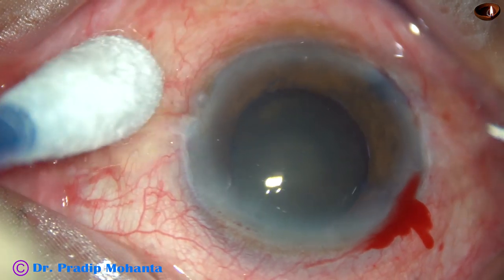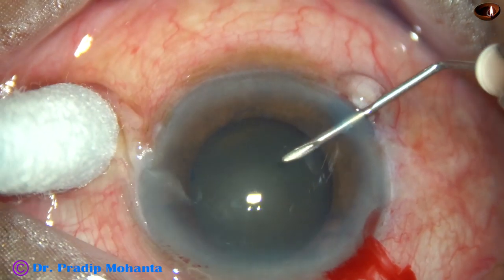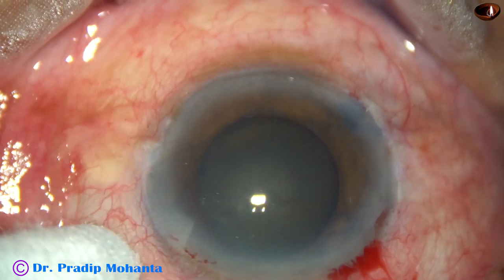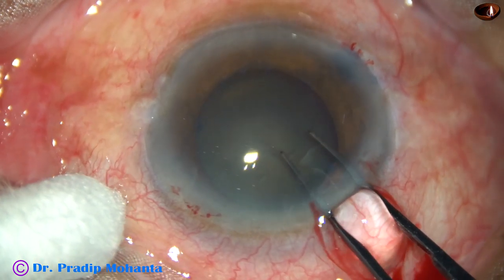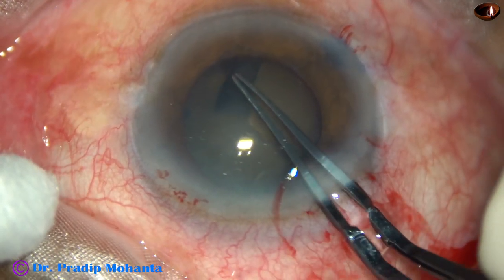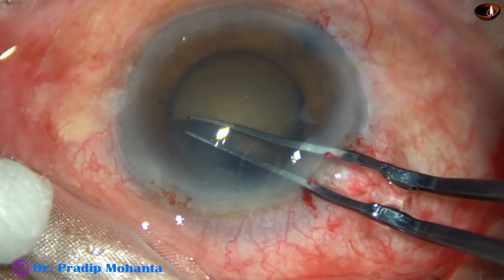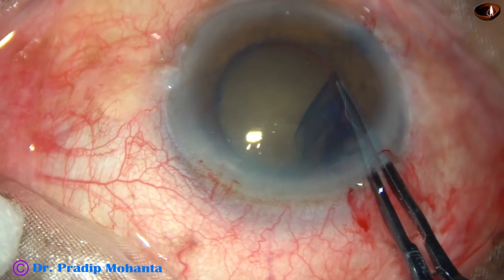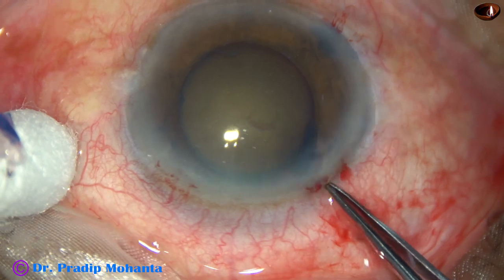Now capsulorhexis is to be done. I use a 26-gauge bent needle cystitome to incise the capsule and raise a capsular tag. Now I use capsulorhexis forceps to hold the capsular tag. In this case I am going almost along the border of the pupillary margin to get an adequate sized rhexis. The cataract is quite hard, about grade 4 nuclear sclerosis, so I need a large rhexis. The size of the rhexis is quite adequate.